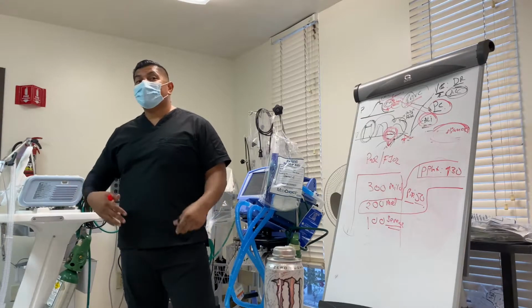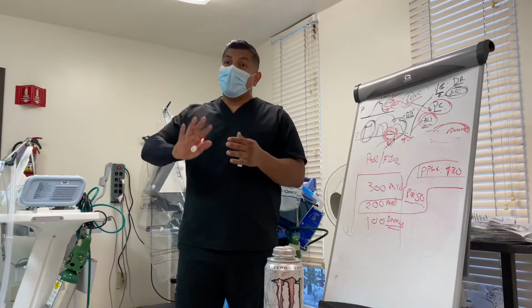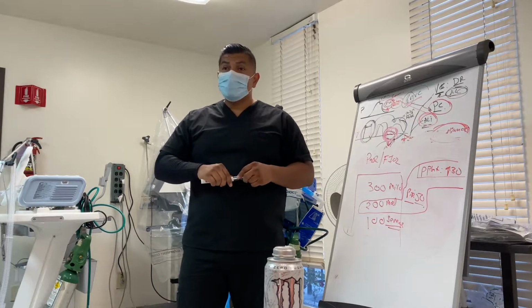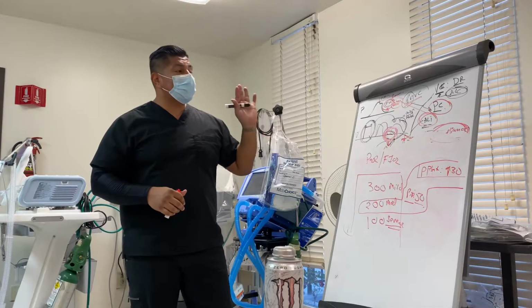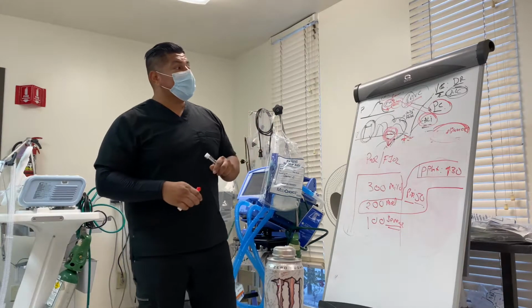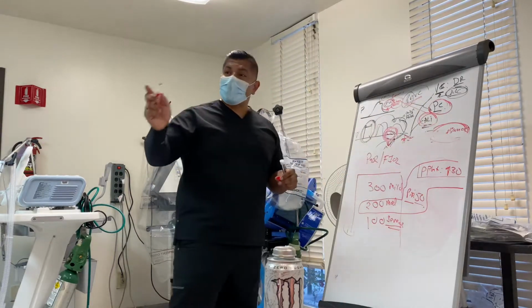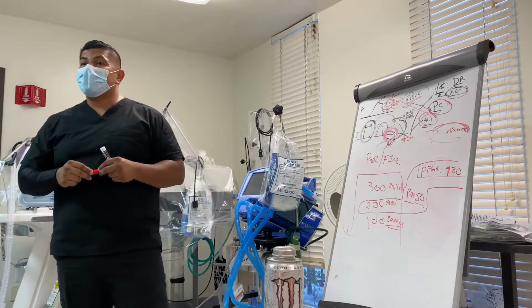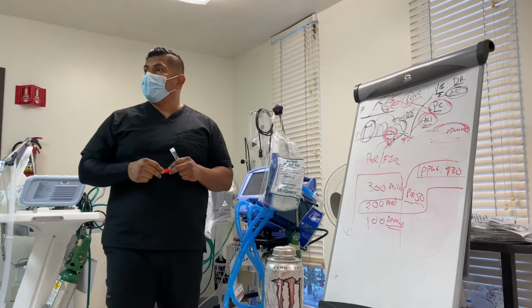What can cause that damage? Anything can cause that damage. Swelling can cause it. Water with all that constant pressure can cause damage. Disease can cause that. Okay? But the problem is that we are looking at the patient's ventilatory needs at that moment to minimize lung injury. You never start on pressure control. You are forced into pressure control because it is a lung protective strategy measure. Does that make sense?